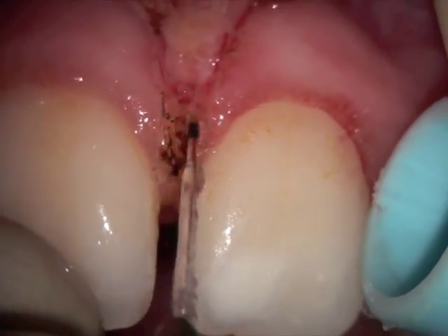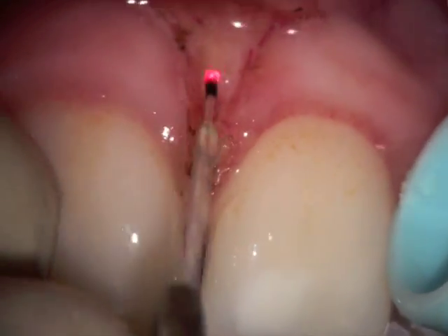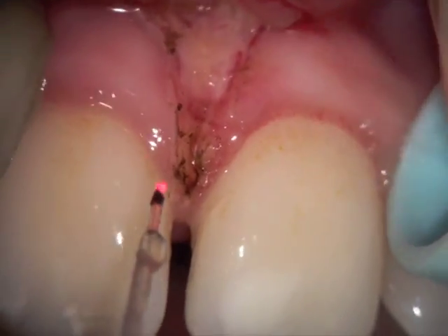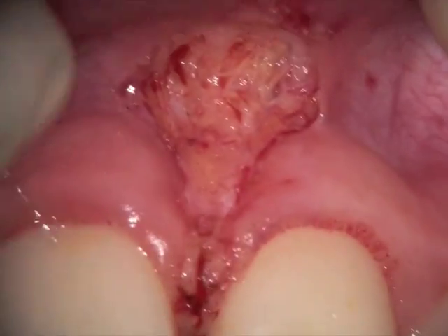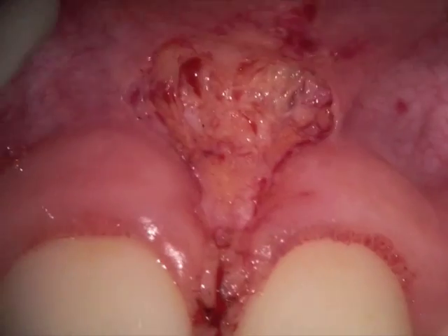We're using continuous wattage with a fine water spray. At this point we're actually using a pulse setting, because I've finished most of the work, and we're now at 2.2 watts with 30 microseconds on and off. You can see the final postoperative result here immediately after treatment. No sutures are used, and we'll see the patient again in 7 to 10 days to re-evaluate the healing.